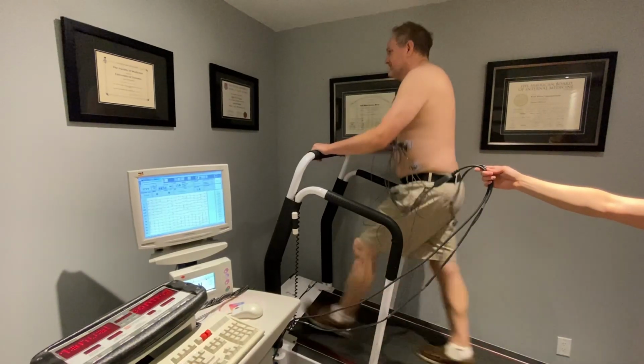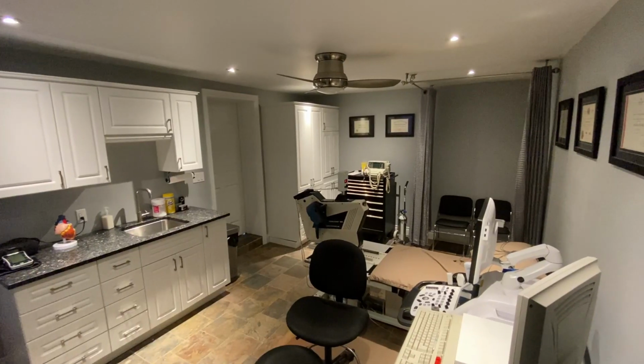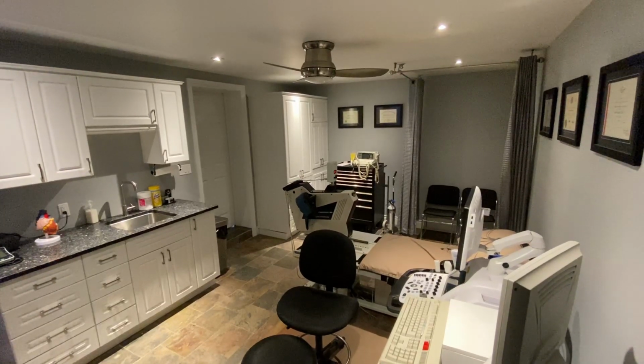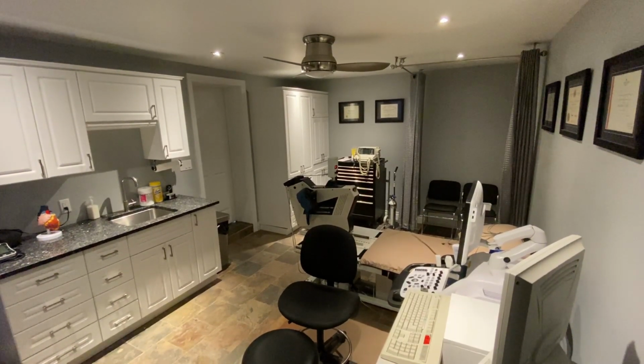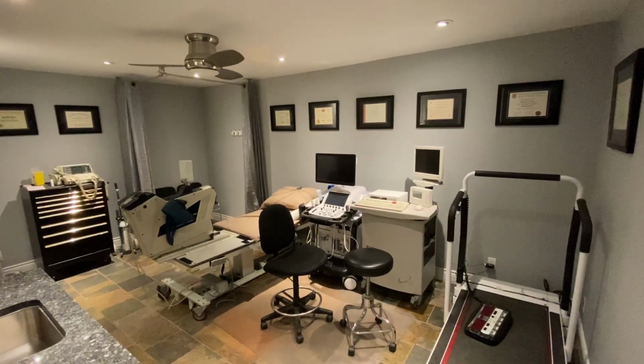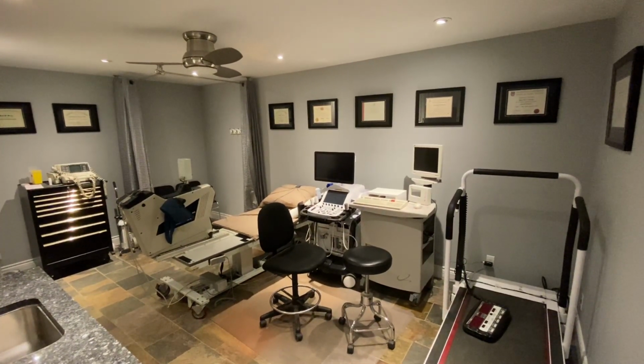There are times, at least 3 or 4 times a year, where I'll stop a test even though the patient has no symptoms and the ECG might be normal, but I do not like the abnormality that we're seeing on the screen as we're imaging. And so this is one of the reasons why it makes the test much safer. The other thing is the ability to image throughout exercise as well as immediately after improves picking up abnormalities as opposed to treadmill stress echo where we only get images immediately after exercise.